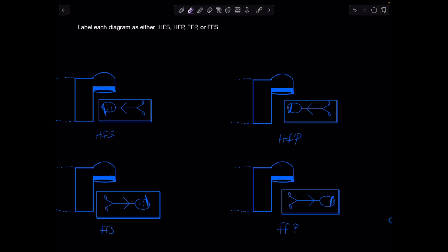So, if you're at the edge of the table, say this is you, right? This is your right hand, and this is going to be your left hand with the correct L, right? So, that's your left, but this is not going to be the patient's left, okay? This is going to be the patient's left. This is going to be the patient's right.